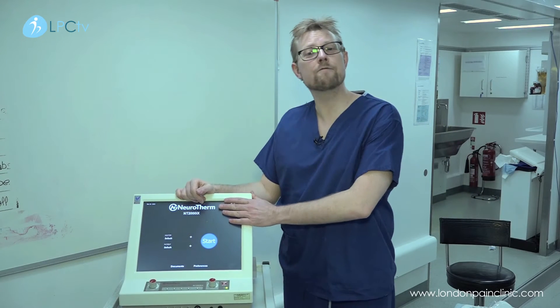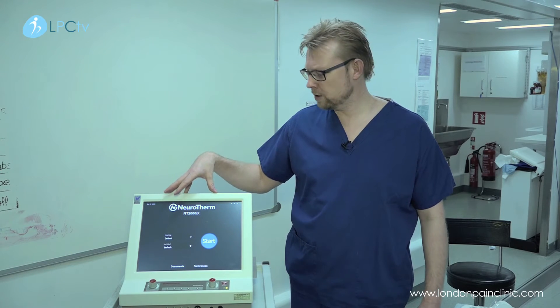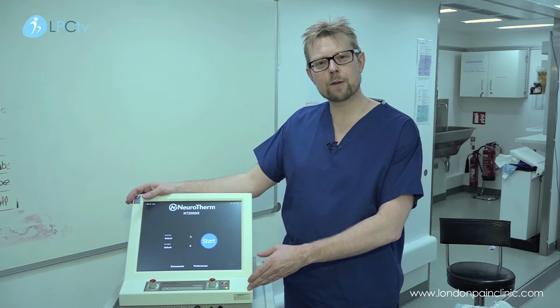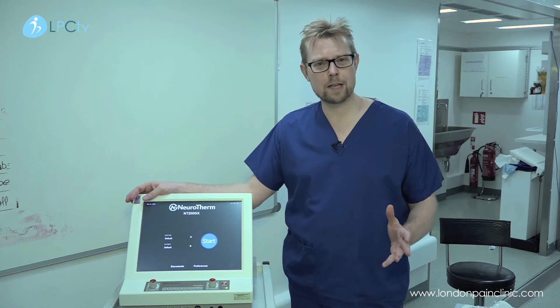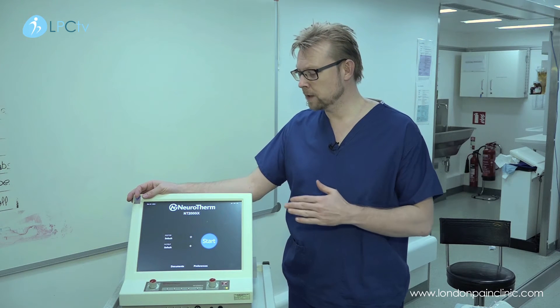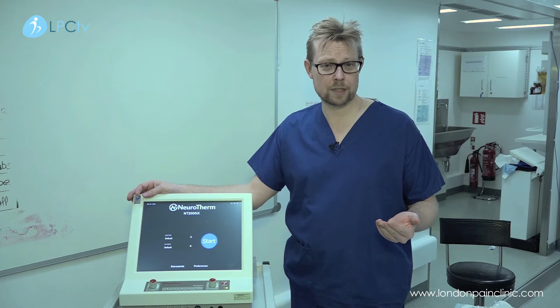This is a radiofrequency machine — one of the latest NeuroTherm machines we use at the London Pain Clinic. Radiofrequency technology has two major modalities: radiofrequency denervation and pulsed radiofrequency. In this video, we are going to discuss radiofrequency denervation.